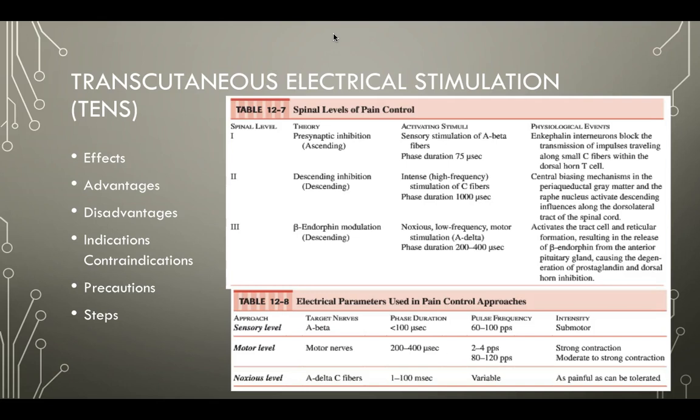We're going to be using a biphasic waveform when we use our TENS on the machines in the athletic training room. So TENS stimulation, again, using the biphasic waveform, is a type of AC stimulation. So again, there's no true positive or negative pole.